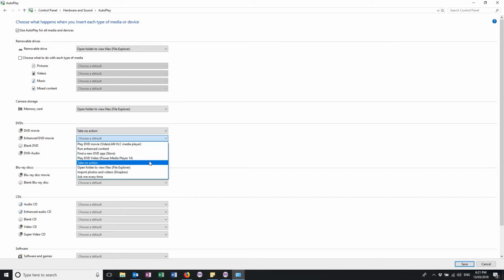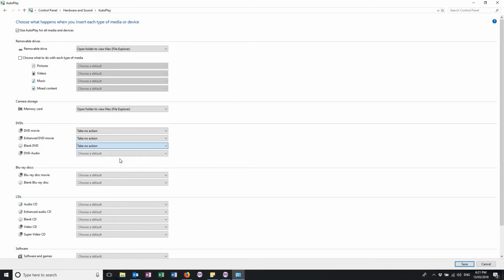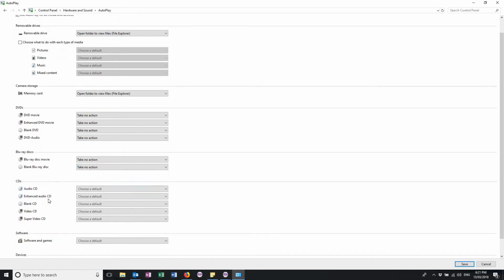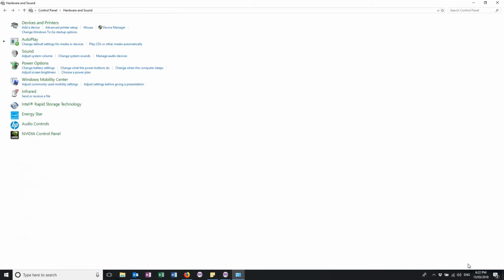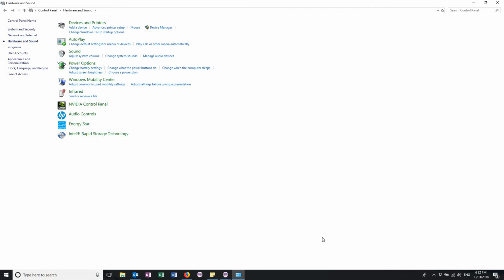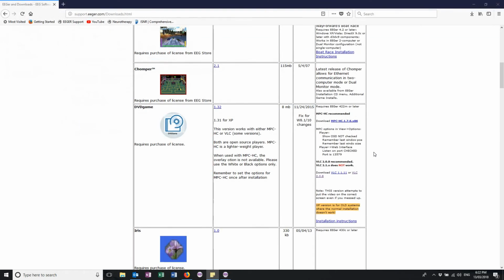Enhance DVD movie, take no action. And you don't need to do it for blank DVD or DVD audio typically, but just to be safe, I do that. So I just go take no action for all of these things. Similarly, I would do that for a video CD, and you could just do it for blank CD or any of these. And then you click on save. So what should happen now is that when you stick a DVD into the drive, it will not play automatically, and that you'll have to open up VLC Media Player and then find the DVD from there.